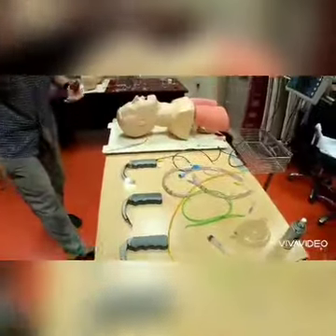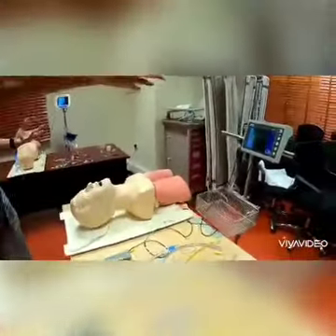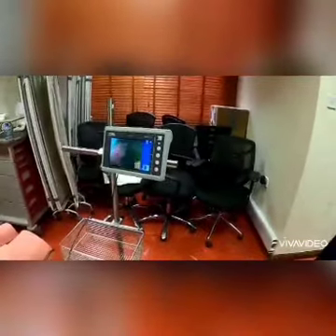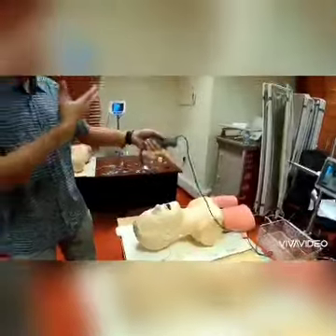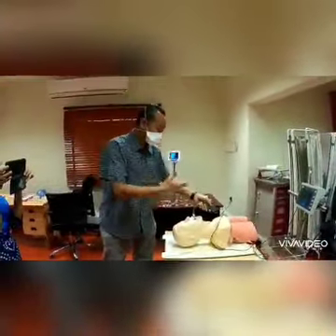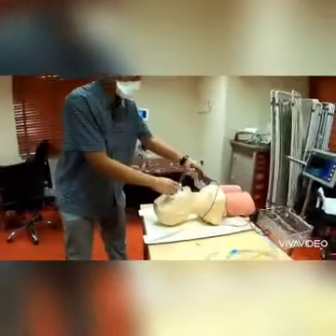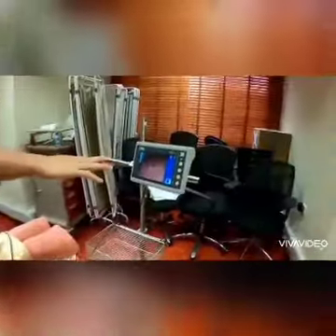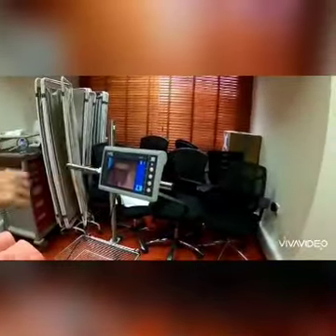The technique is that you use a big screen instead of a small screen if you have one, and you stand quite far away from the patient. Make sure you put on your PPE. You enter the mouth, and the view that you want is the tongue inside the view.